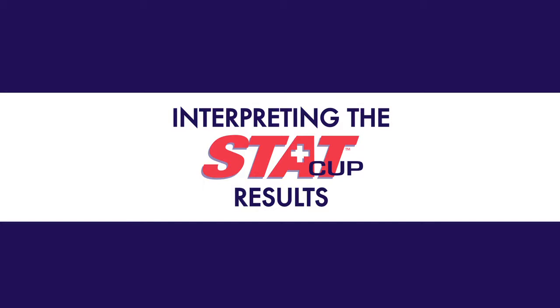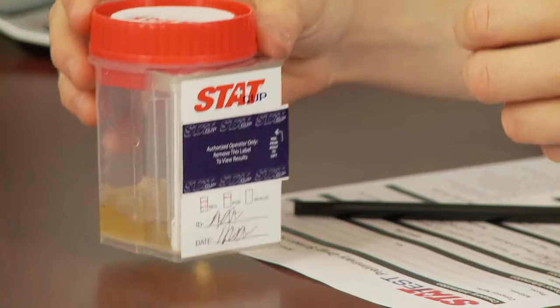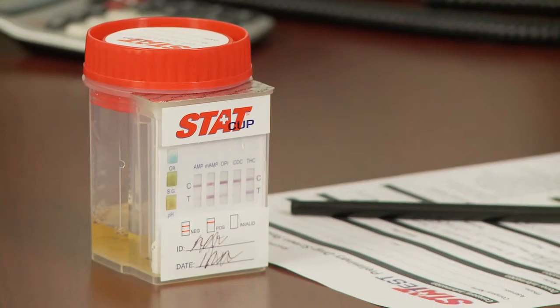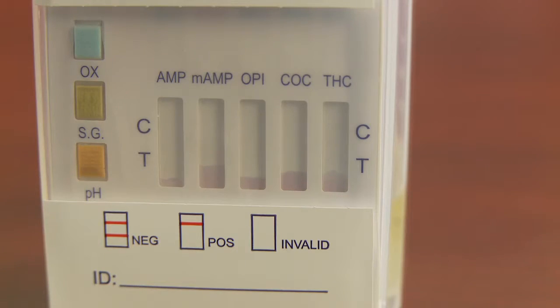Interpreting the StatCup results. After you have determined that the specimen is valid, peel off the blue label to observe the test as it begins to run. You should notice a pinkish color migrating up the test strips. Negative results may be interpreted as soon as they appear. Allow 5 minutes to pass before interpreting preliminary positive results. All test results are stable for 1 hour.